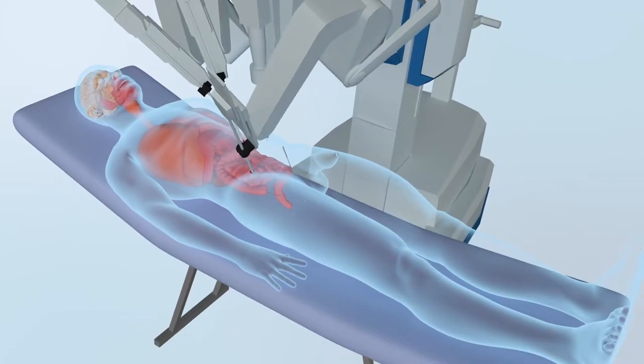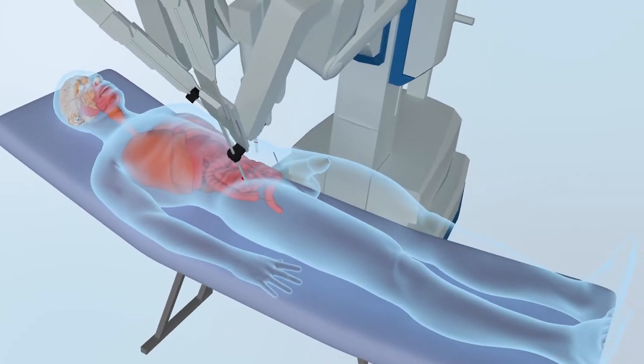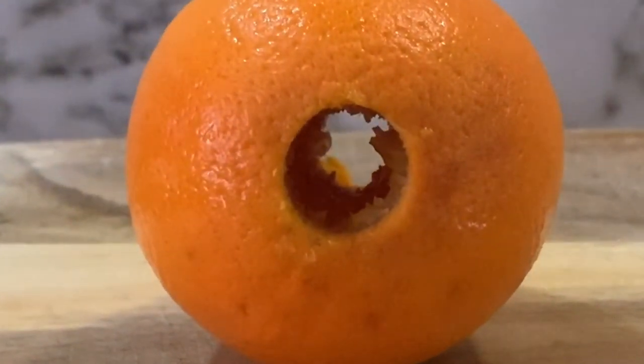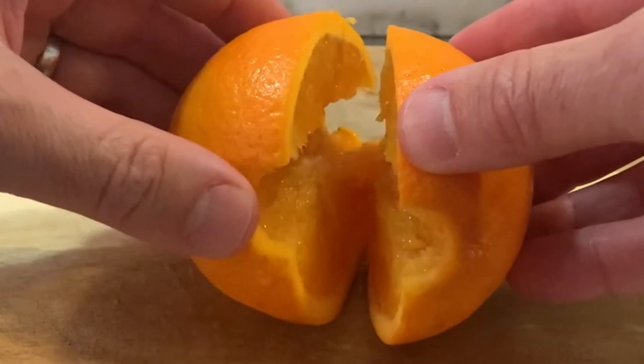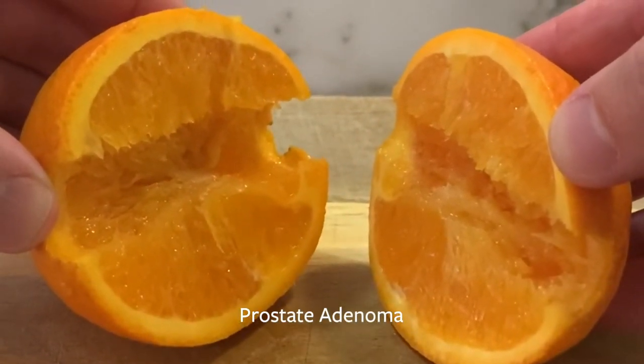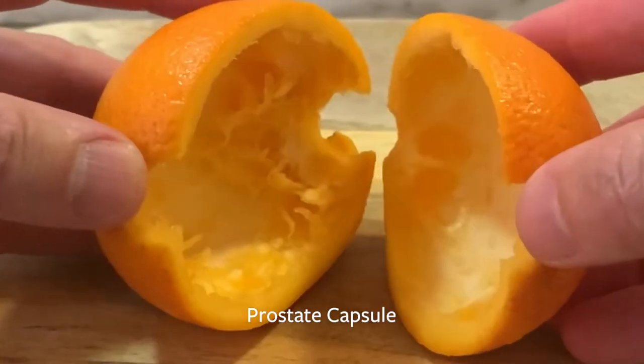What is a robotic simple prostatectomy? A robotic simple prostatectomy is an operation to remove the inner core of the prostate via keyhole incisions with the assistance of a robot. The operation is similar to removing the pulp of an orange while leaving the outer skin or rind intact. The pulp represents the prostate adenoma blocking the urine flow, and the skin or rind represents the prostate capsule.